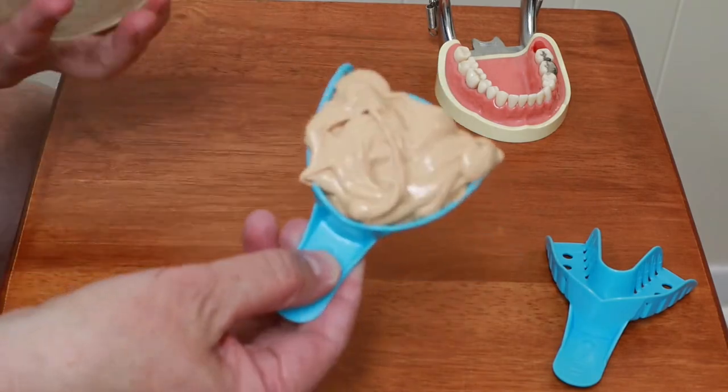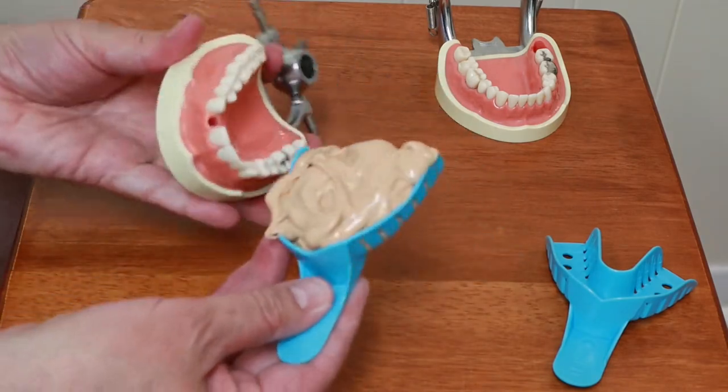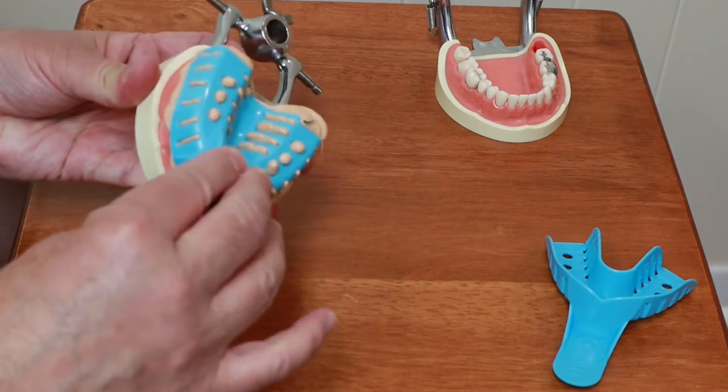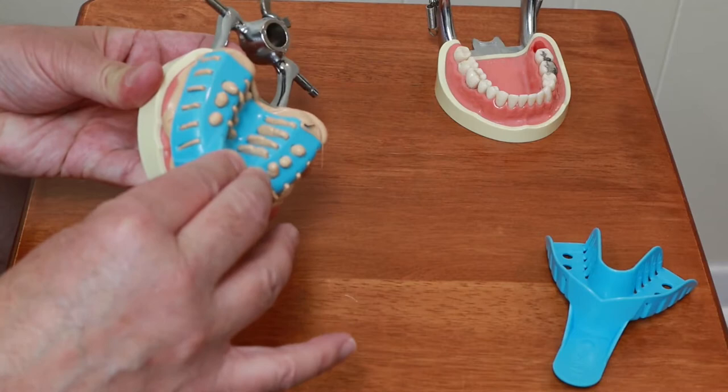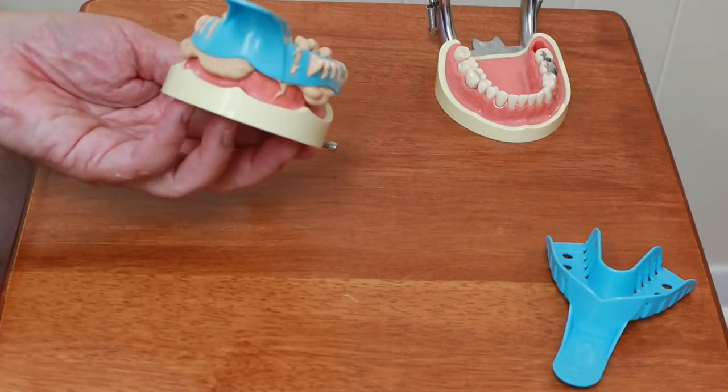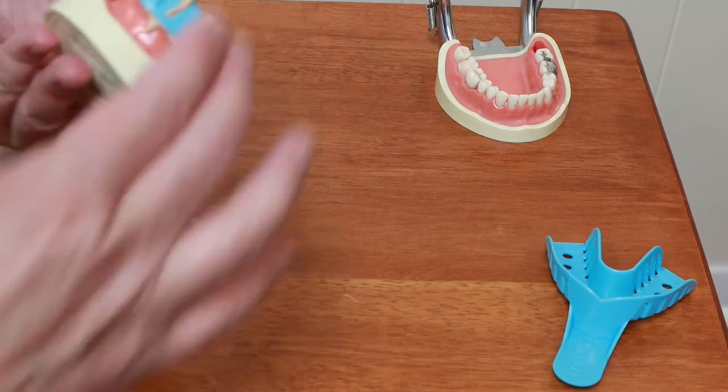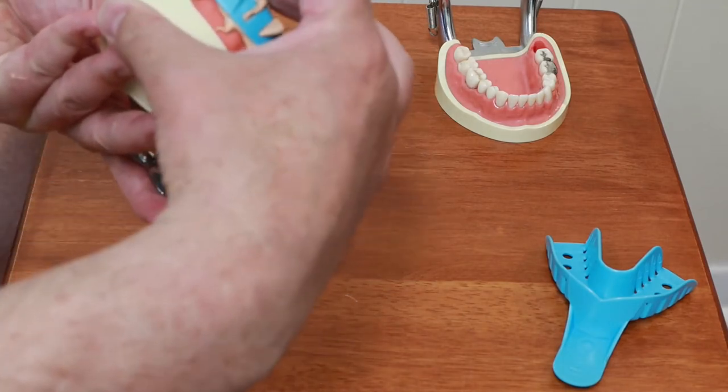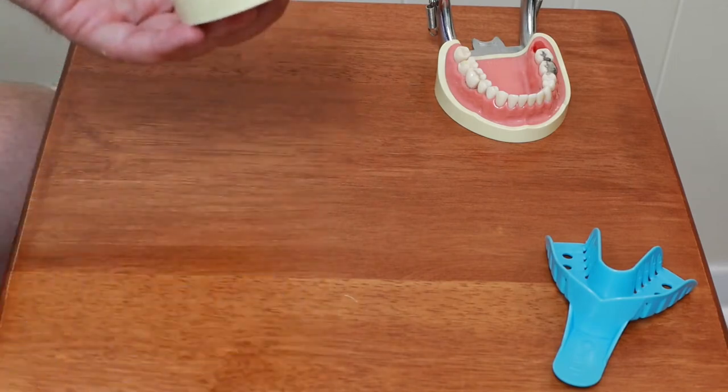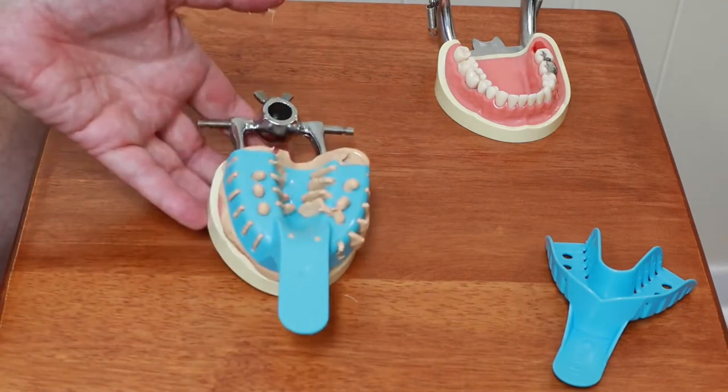Once I have the material in the tray, let's take the mold. Just got to let that set up and make sure I get the front teeth. That takes about two minutes to set. I'm just going to set that aside.